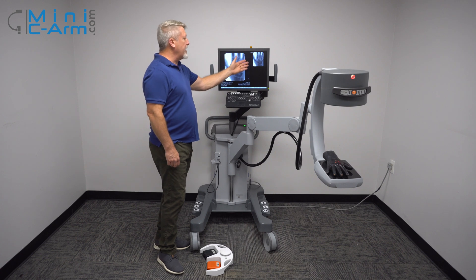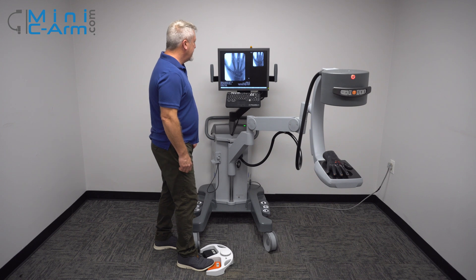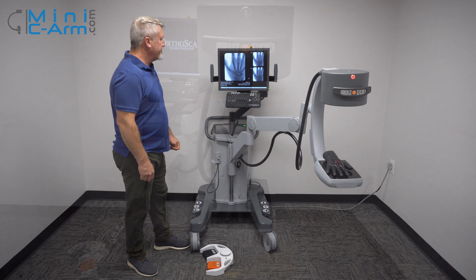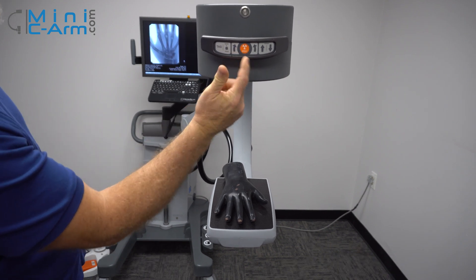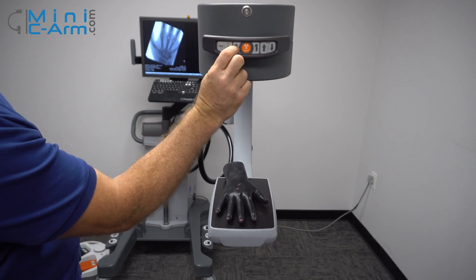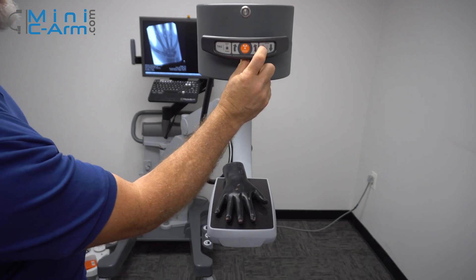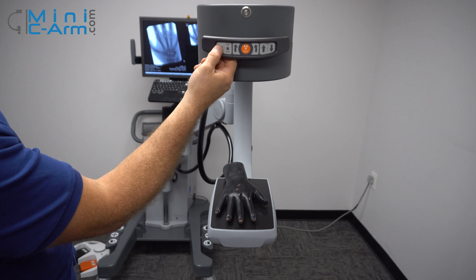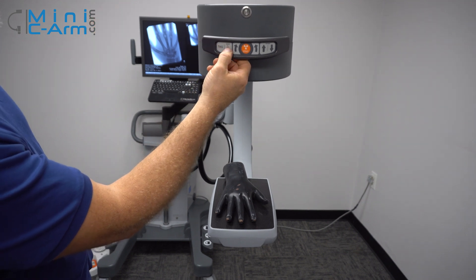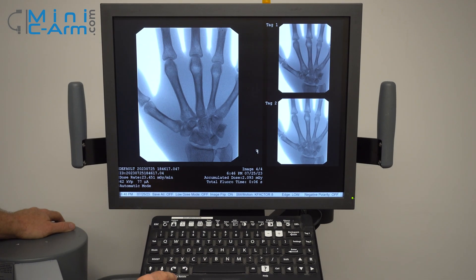This way it gives the machine time to populate the last image hold area. Here we can see the two pad controls: X-ray, rotate clockwise, counter-clockwise. You can change the technique to go up or down. You can also tag your images, print and save. While you're imaging, if you want to rotate the image, you can use the clockwise or counter-clockwise image rotate buttons.